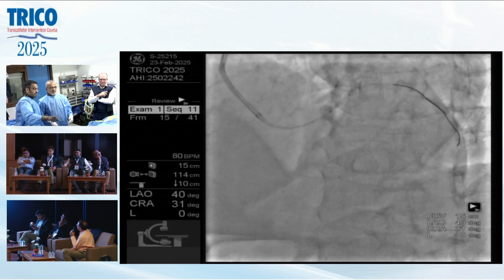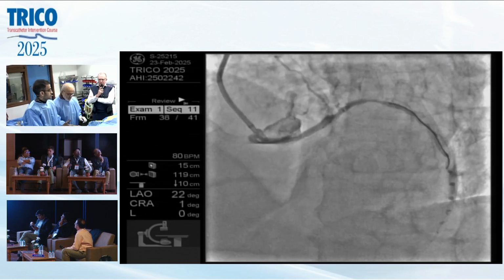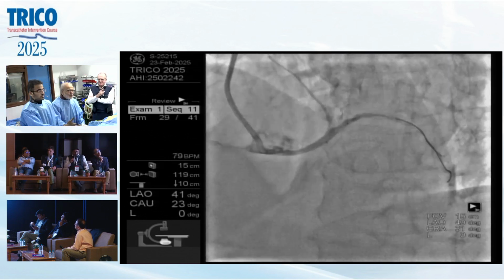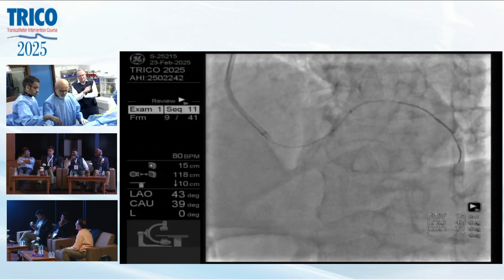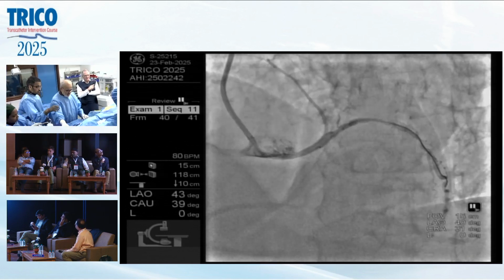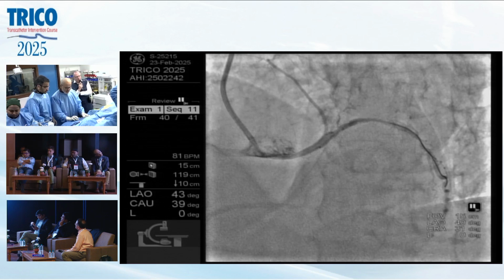LAO caudal. Were you thinking then of not doing intravascular imaging here? Not before stenting. Then just wait. Let us remove this crowding. So you're confident on the stent size and length here?